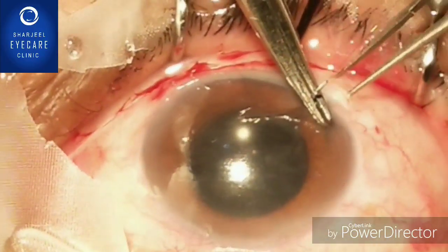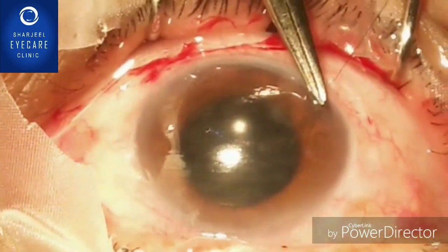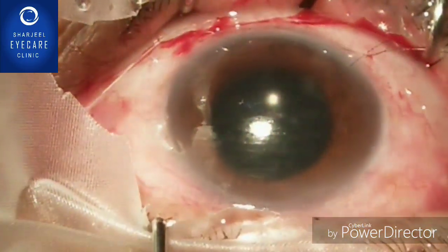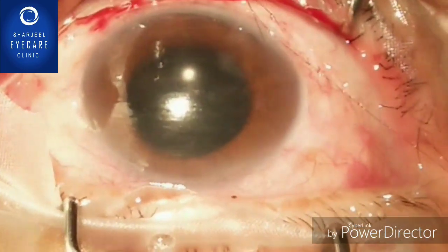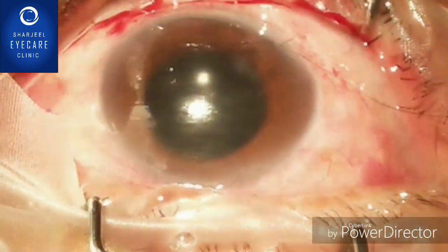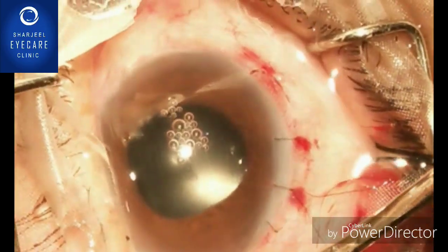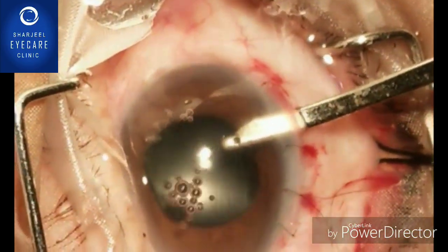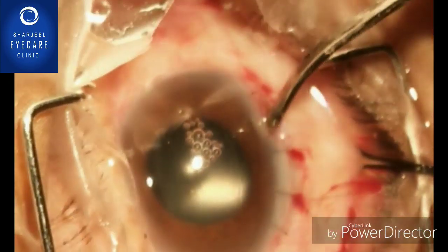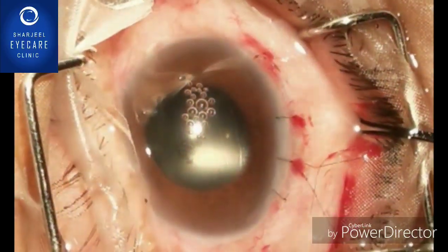Place the haptics in such a way that they serve the purpose of a CTR — capsular tension ring. Since the subluxation was superior, one haptic should be at 6 o'clock and the other at 12 o'clock. Make sure the intraocular lens doesn't move and become horizontal — it should be vertical, so the superior haptic expands the bag just like a capsular tension ring. The IOL is now working as a CTR; it's in the bag with no downward subluxation.